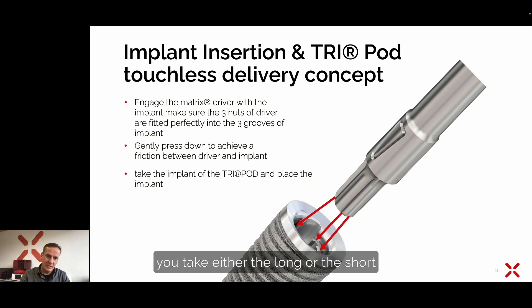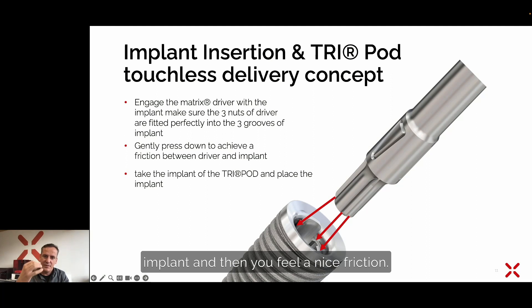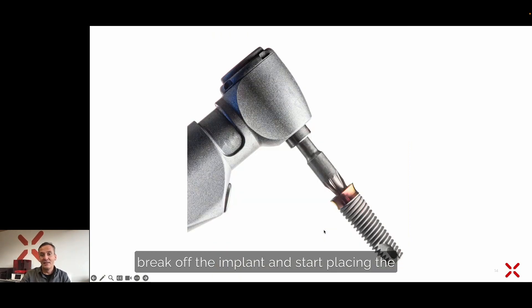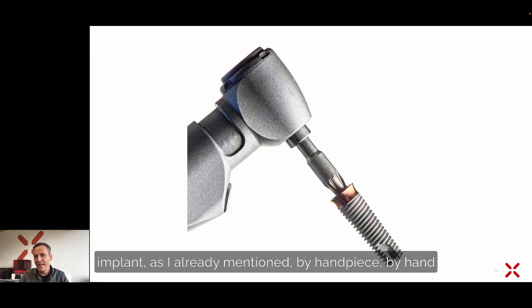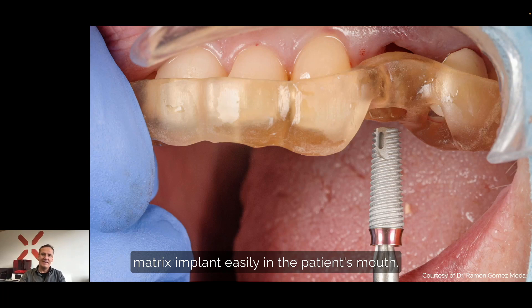For placing the matrix implants, take either the long or the short matrix driver out of the surgical kit. The driver has three grooves, and you press these three grooves slightly into the corresponding grooves in the implant until you feel a nice friction. When you reach this friction, you can break off the implant and start placing it — by handpiece, by hand with the adapter, or with the torque control. This is how you can easily place the matrix implant in the patient's mouth.